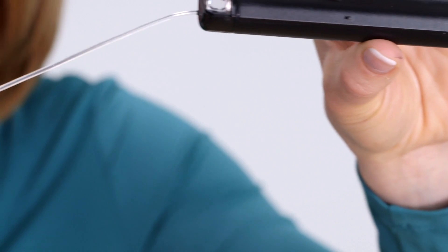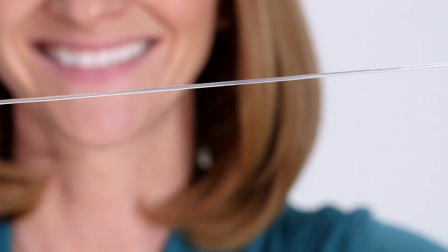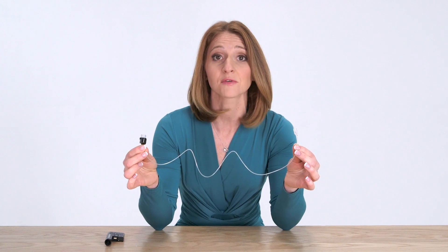Another part that you will need is the infusion set, or the tubing that delivers insulin to your body. SNAP's infusion set is unique in that it automatically fills the tubing for you. It is different than other pumps — there is no waiting, priming, or rewinding like other pumps require.